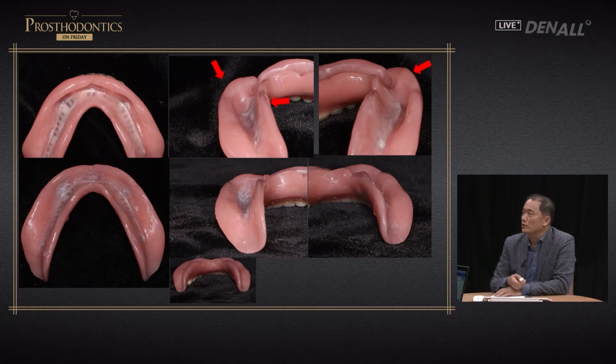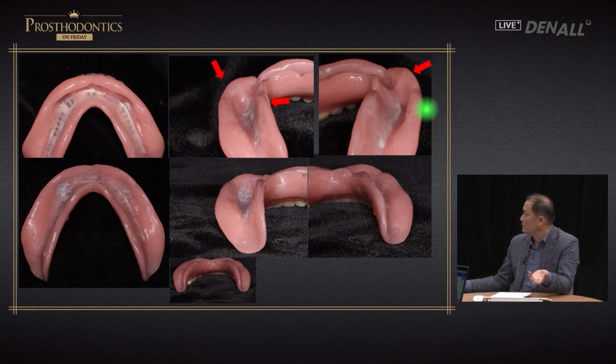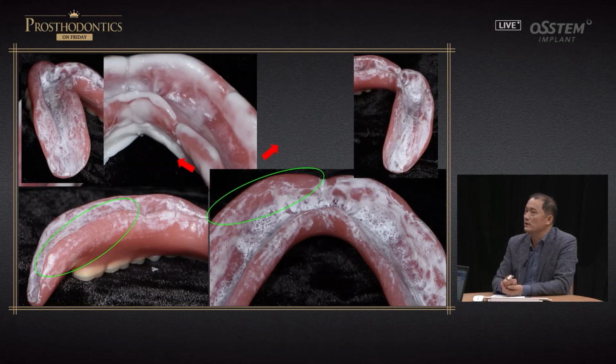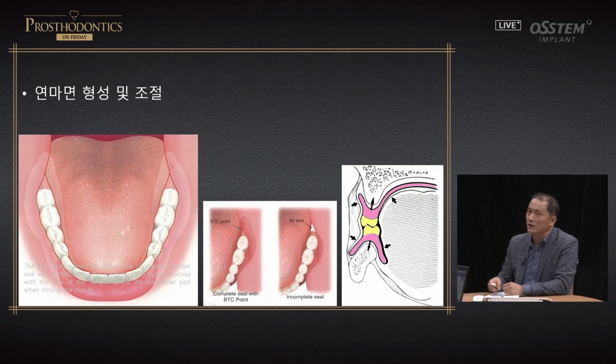Hence, even visually, if an area is too thick, then even horizontally using fit checker, you have to make adjustment. And here is the adjusted result. So the lingual or the labial areas, you see, have become thinner, and you see it's much better functionally. So for this case, we had laboratory conditions to make it, but we had a lot of adjustment to make it harmonized.